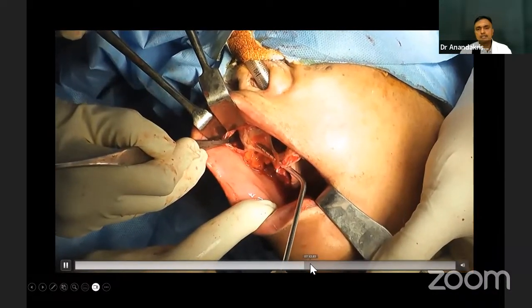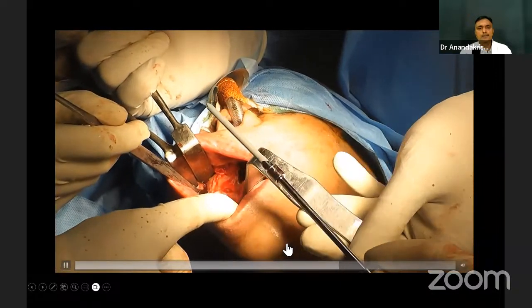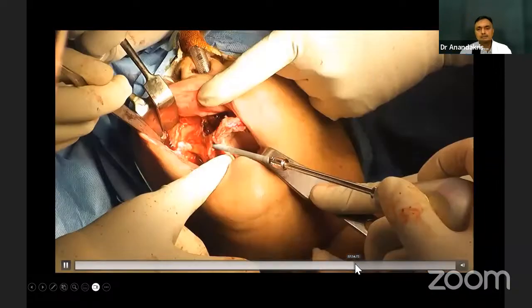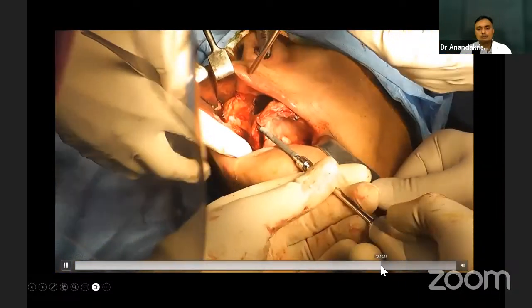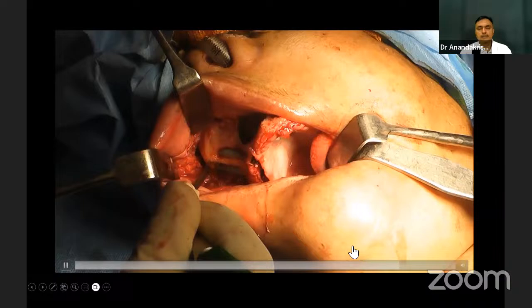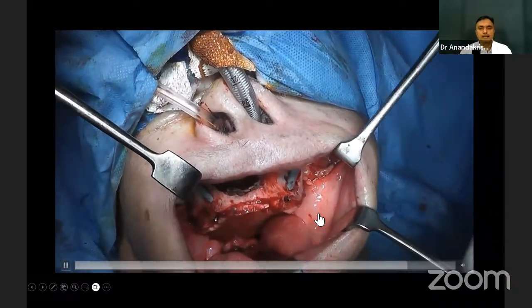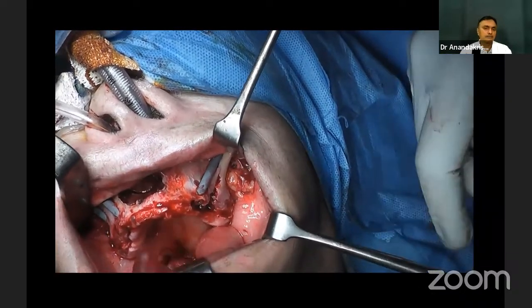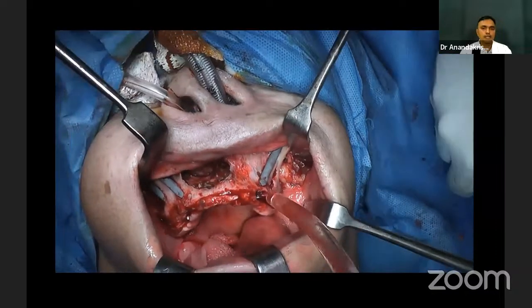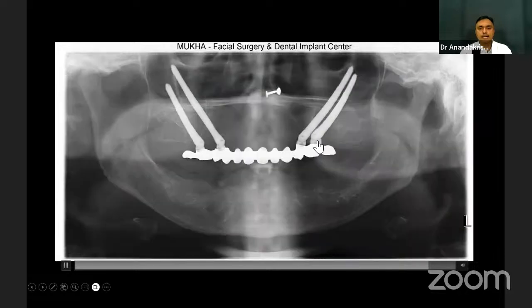So once the implants are placed, so that's both sides of the implants. I'll just quickly rush through this. All the 4 implants had gone in, and that's how it looks after the 4 implants have been placed. So we're happy with the positions. These are zygomas with an angled neck. You want the angle to be pointing downwards.